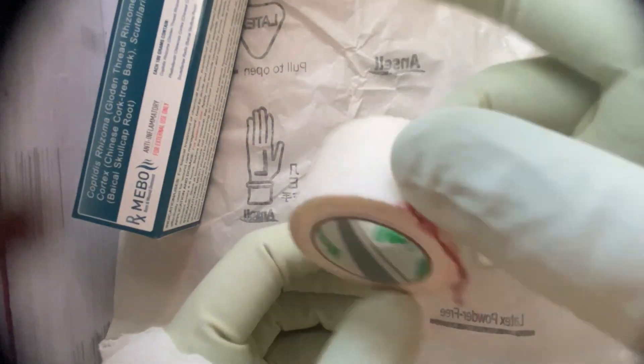You can use elastic bandage because it is easy to remove when you change the dressing. Secure the gauze with an elastic tape so it will not fall down or get pulled out with any movement of the patient. You can use any elastic tape available nearby. This is how you can dress a wound at home if you are far from a hospital or cannot afford hospital bills.